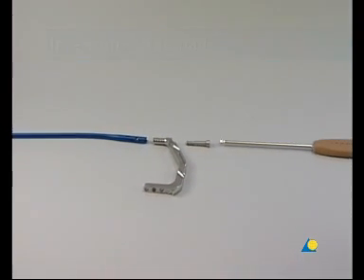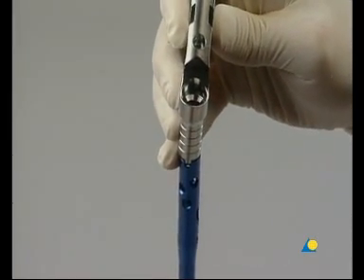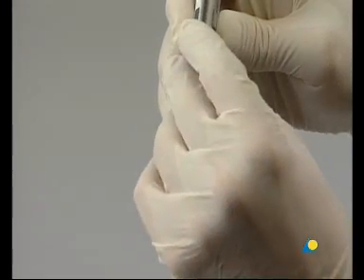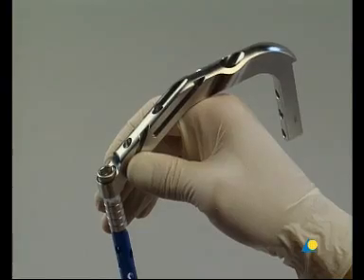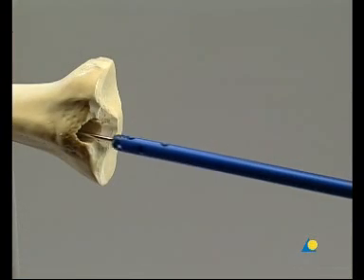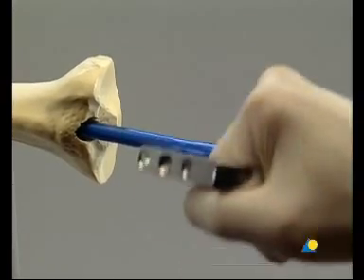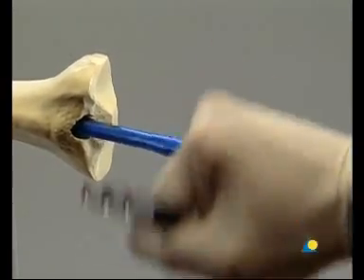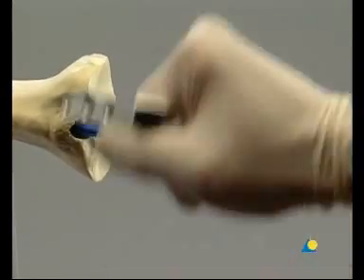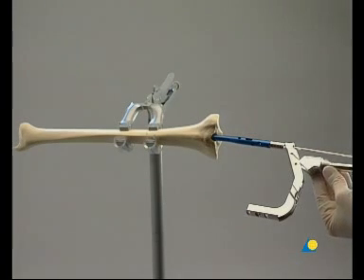The insertion handle is directed anteriorly, and the tongue of the handle is matched to the notch in the nail. The connecting screw is placed through the insertion handle and is threaded into the nail using the hexagonal screwdriver with spherical head. With the insertion handle, the nail is introduced into the medullary canal. Slight rotational movements can help the insertion. The passage of the nail across the fracture is monitored with the image intensifier in two planes to avoid malalignment and additional iatrogenic fractures. If necessary, light hammer blows may be used.